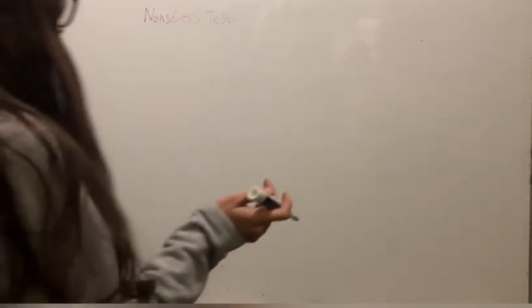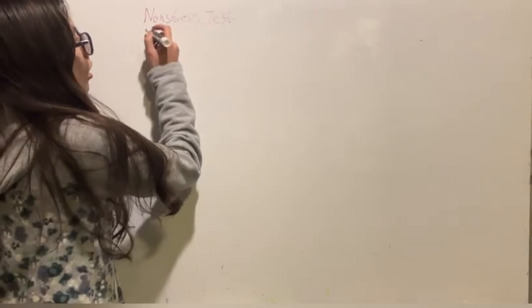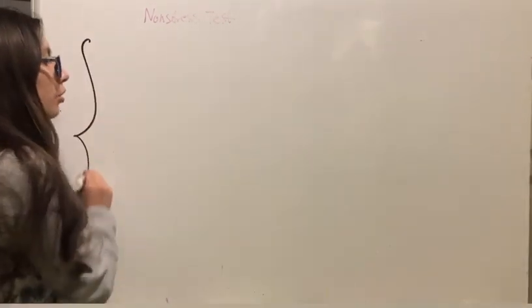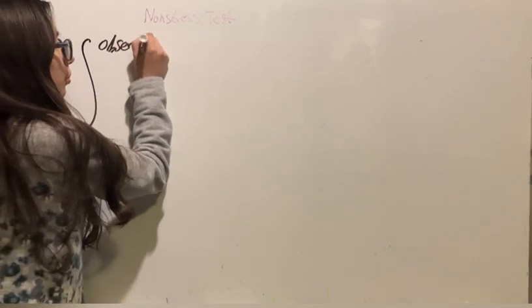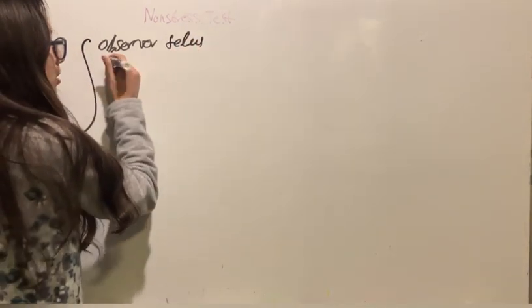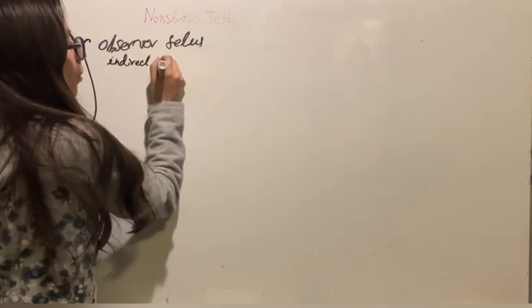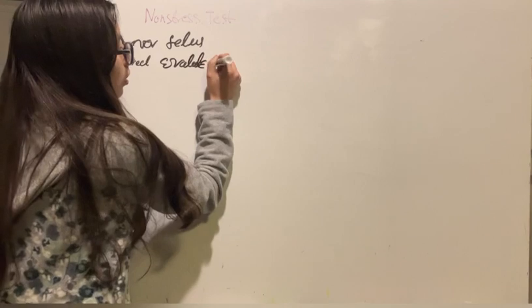Now let's see the non-stress test. As its name implies, this is a non-stress test. This is a test in which we are just going to observe what is happening with the fetus. And let's say this is an indirect way to evaluate for fetal movement.